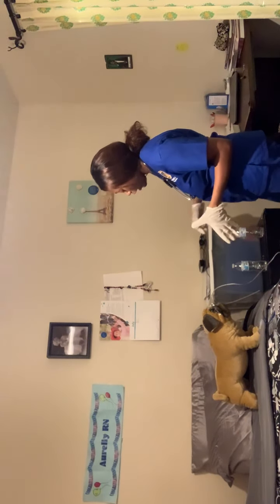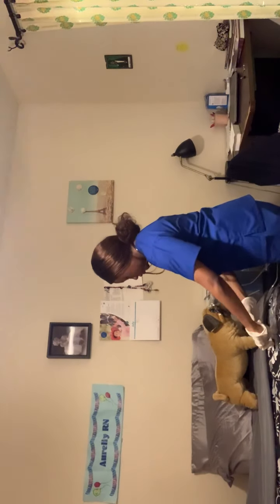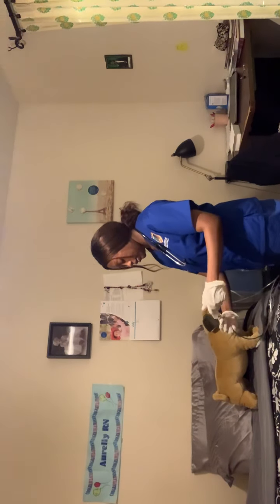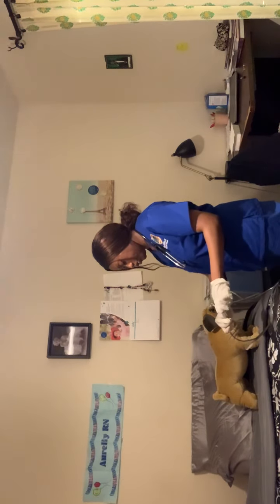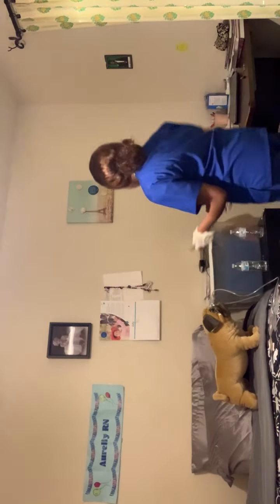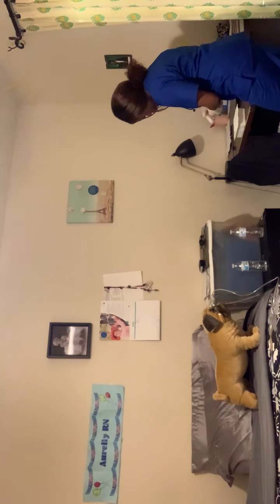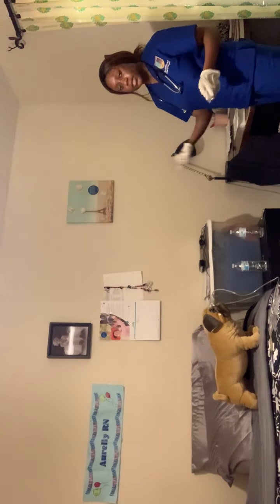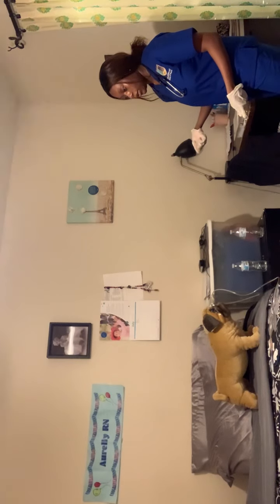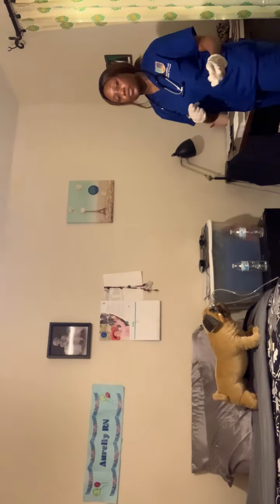And now I would place my syringe, and I would extract the gastric contents. I would go and dispose of it in my gastric container. I would do a pH and verify that it's within normal limits. And then I would verbalize that I would take it to the x-ray if it was needed for feeding.